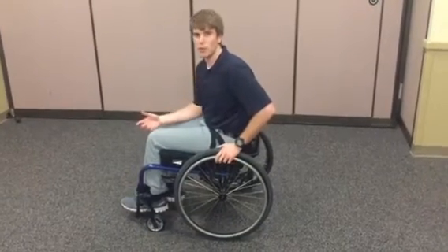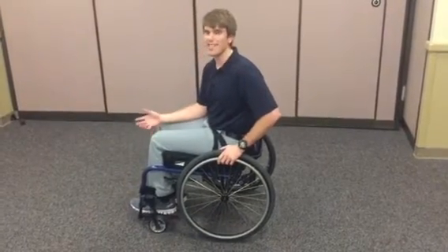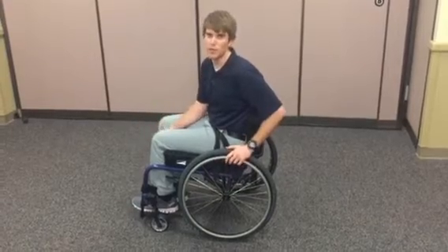Now I'm going to show you how to right the wheelchair once you've fallen. We teach this because everyone is bound to fall at some point.